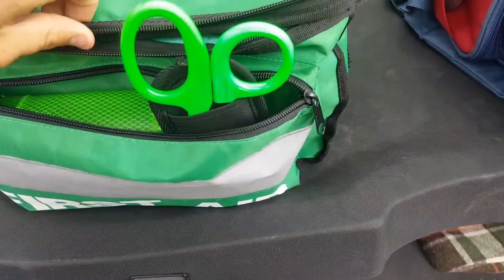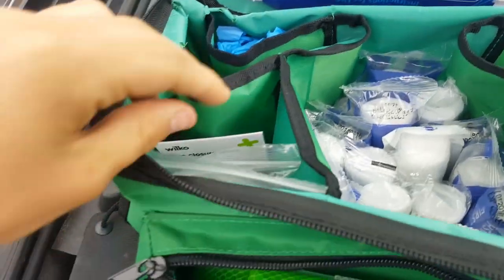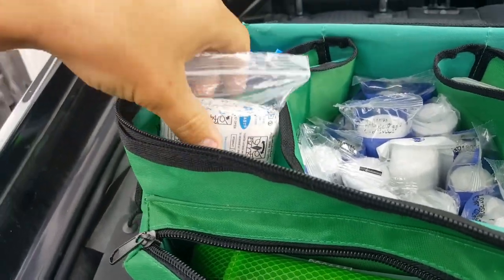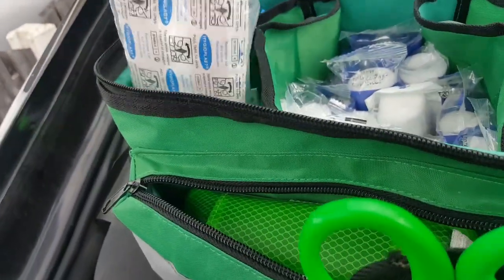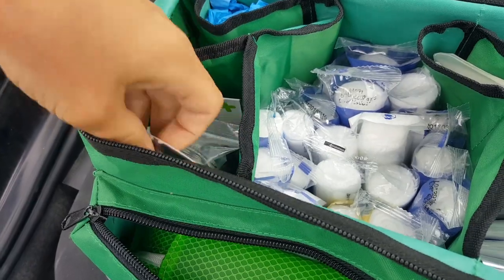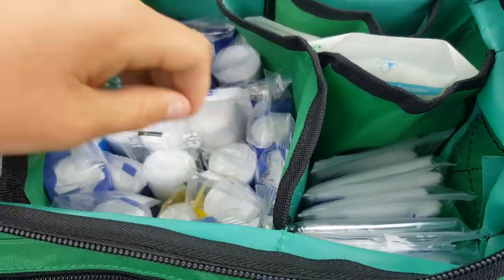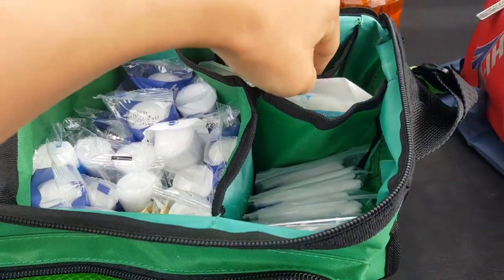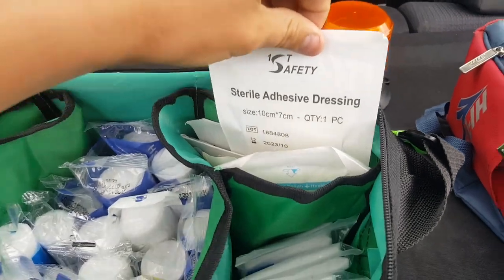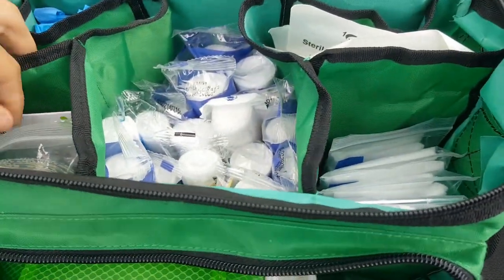As we open it up, you've got some burns gels in there with some big plasters. We have some skin closure strips like butterfly stitches, some plasters, and a bigger plaster. In here we have lots of different bandages — a stretch bandage and all sorts of bandages, a large first aid dressing, finger dressings, an adhesive dressing, a foil emergency blanket, and a triangular bandage.